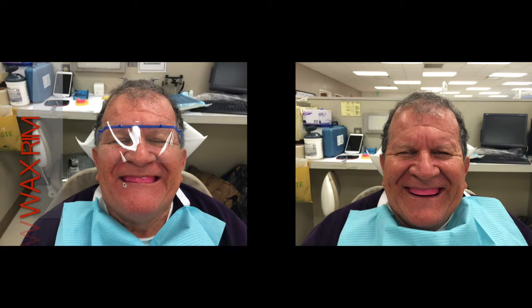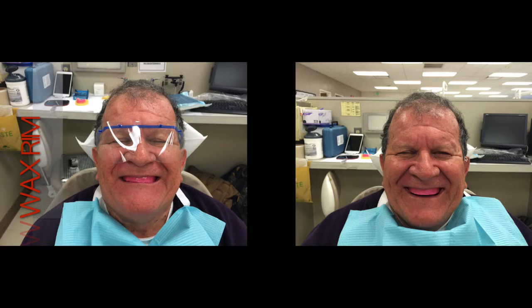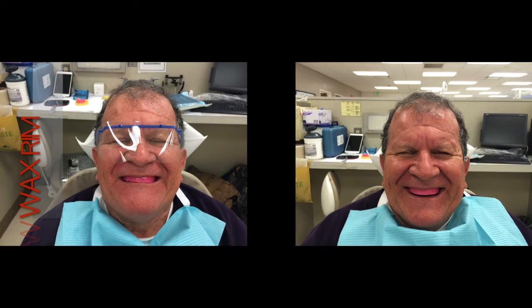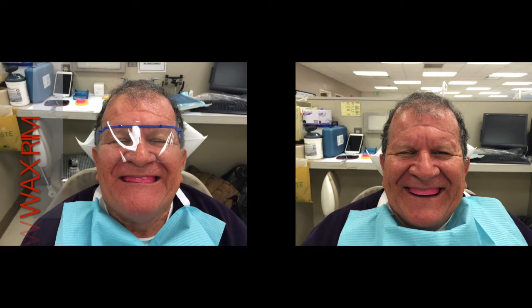The image on the left is before adjusting — you can notice the occlusal plane is too tilted. The image on the right shows the correct occlusal plane. The frontal view now shows it is parallel to the interpupillary line. When evaluating the try-in denture, your occlusal plane should follow these reference points correctly to make the final denture look pleasing and functionally correct. This concludes our discussion of occlusal plane references in XYZ positioning.